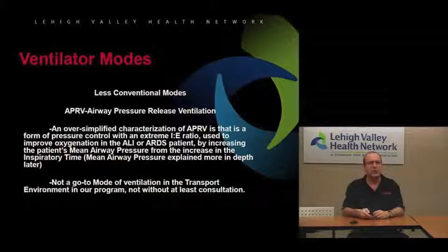But this isn't something we'd probably make a decision on our own to go to. Maybe if we're picking somebody up that's already on an APRV setting and they're doing well with it, maybe make a quick phone call back here to Lehigh, talk to the attending or the on-call respiratory person, senior respiratory person, and see if everything's good to go. Definitely, if you think you're going to make that switch on your own, you probably want to consult somebody on that.